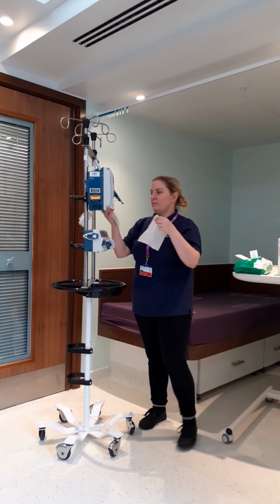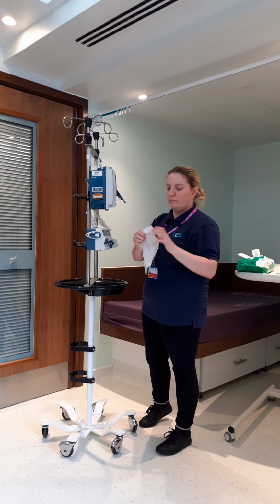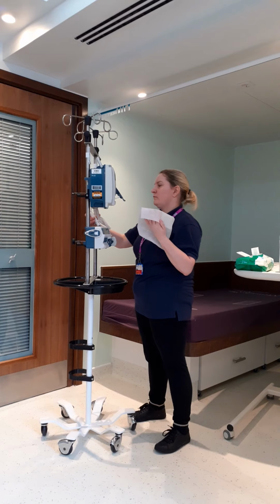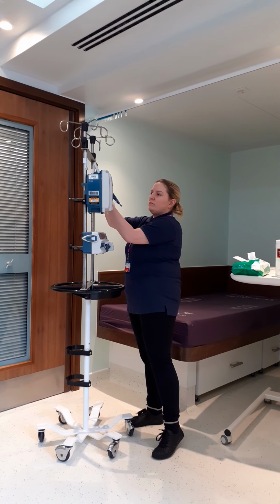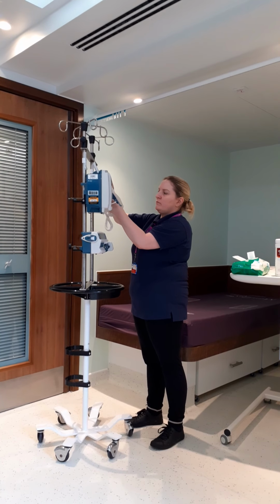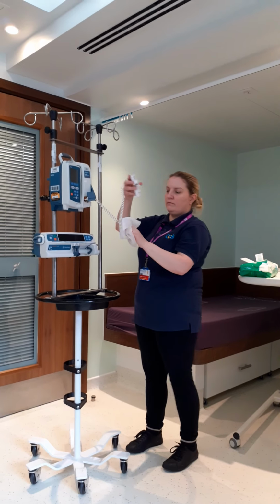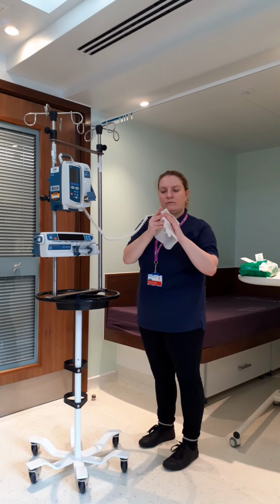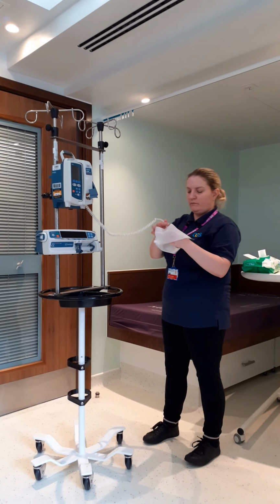Now, we're currently cleaning the pumps themselves. This is because these are the bits that are frequently touched and therefore probably are going to be contaminated. But also, unlike normal where we clean from clean to dirty, we want to clean these pieces of clinical equipment and be able to take them off onto a clean surface before we clean the rest of the drip stand.